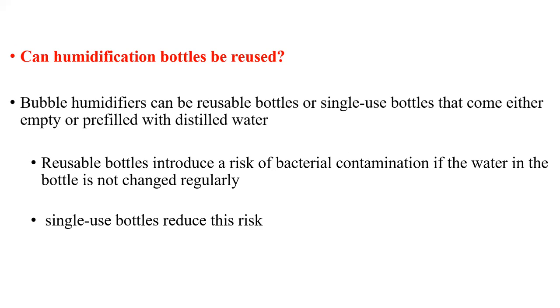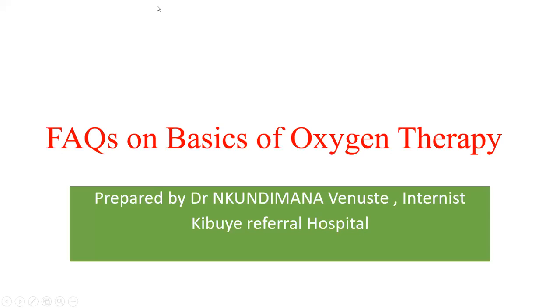Okay, can a humidification bottle be reused? Yes, those bottles can be reused, but after cleaning them. Sometimes you can find a single-use bottle to reduce transmission of infection. I think that's the end of my presentation. Maybe we are going on to the basics of oxygen therapy in the time we have. Thank you.